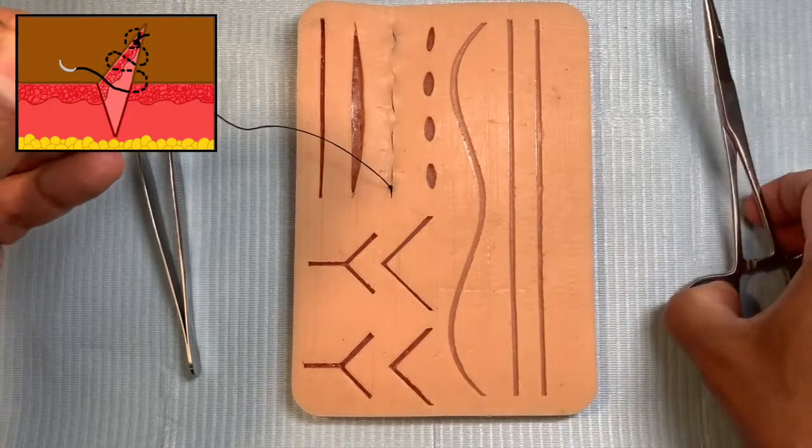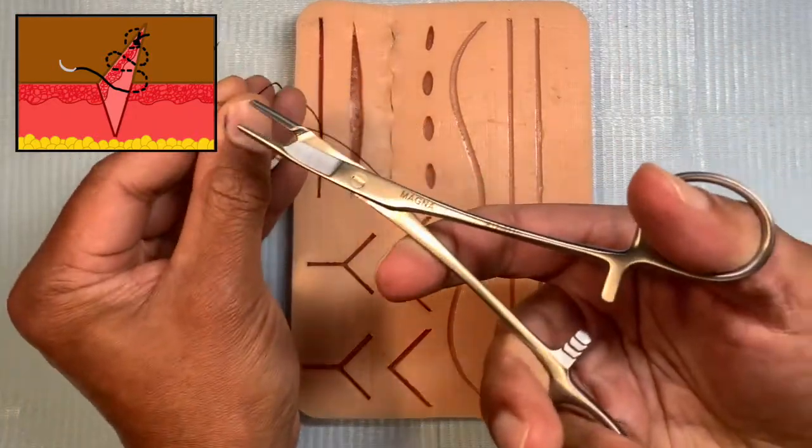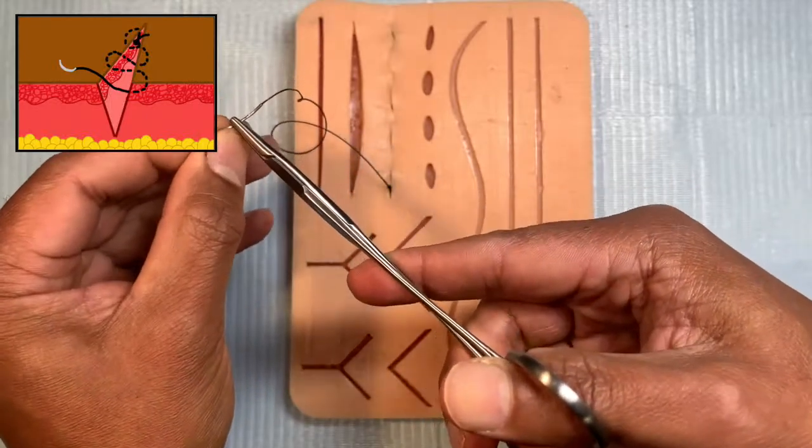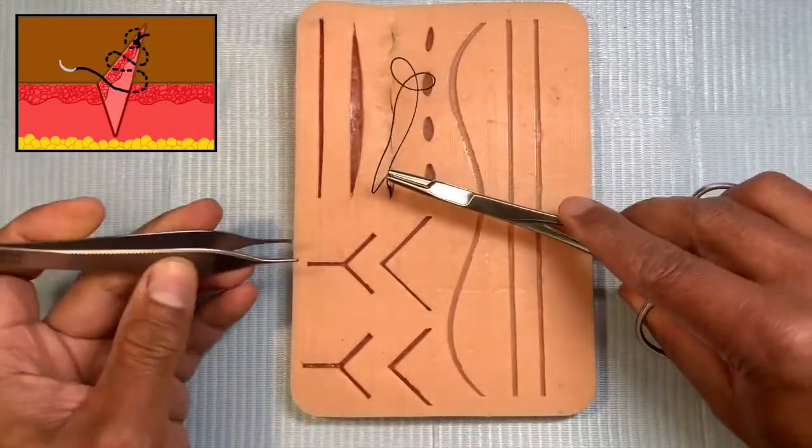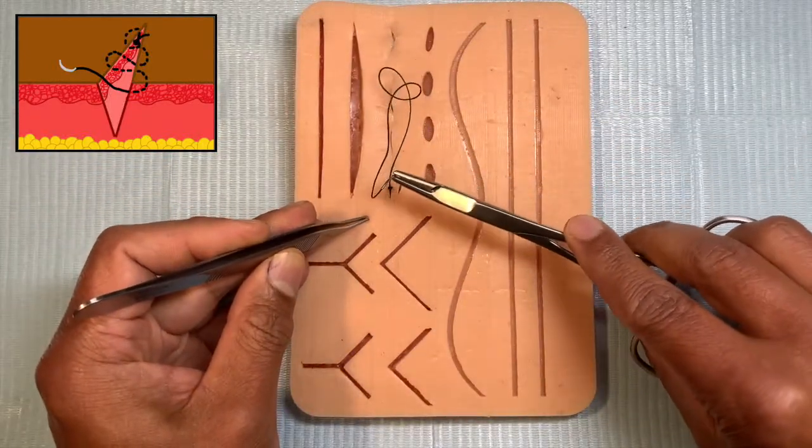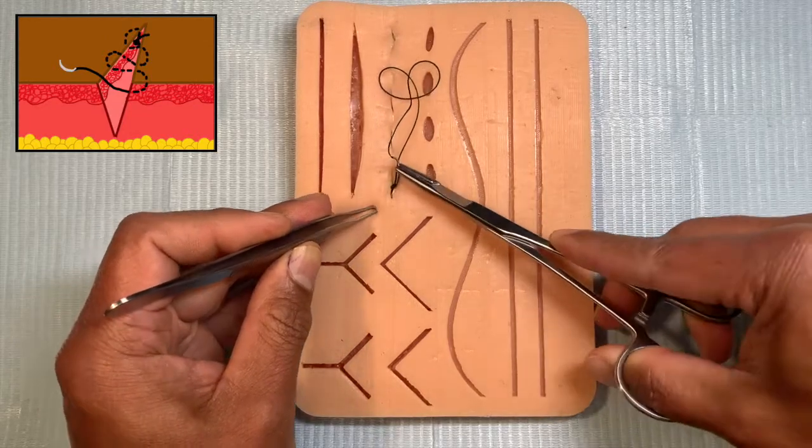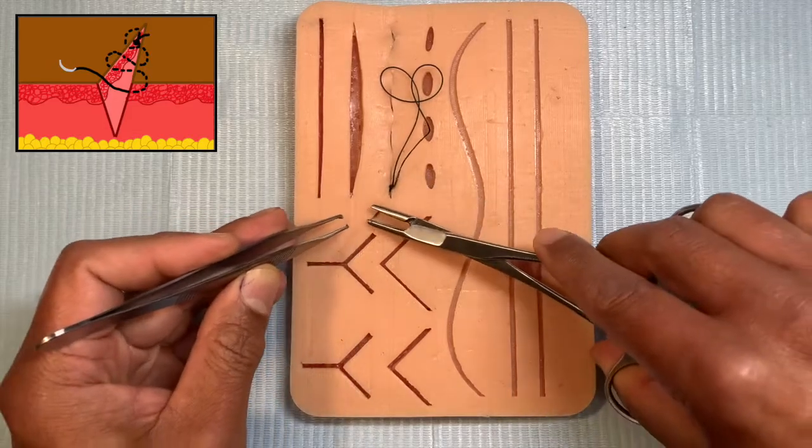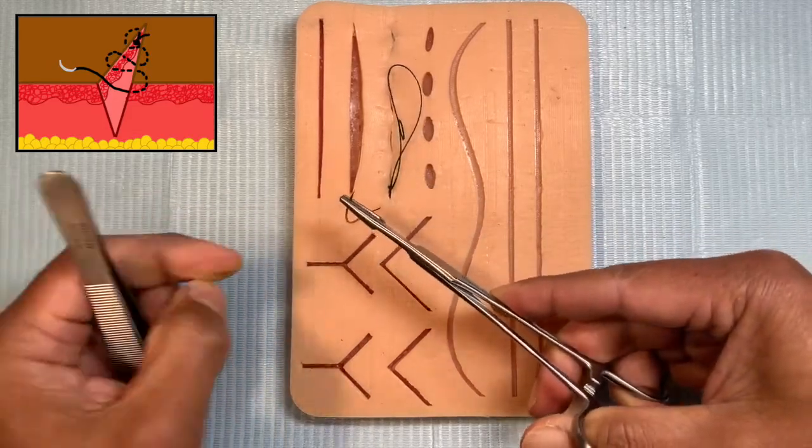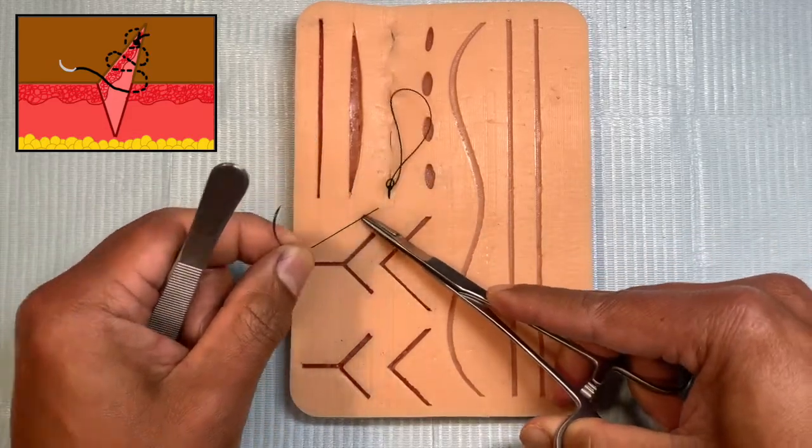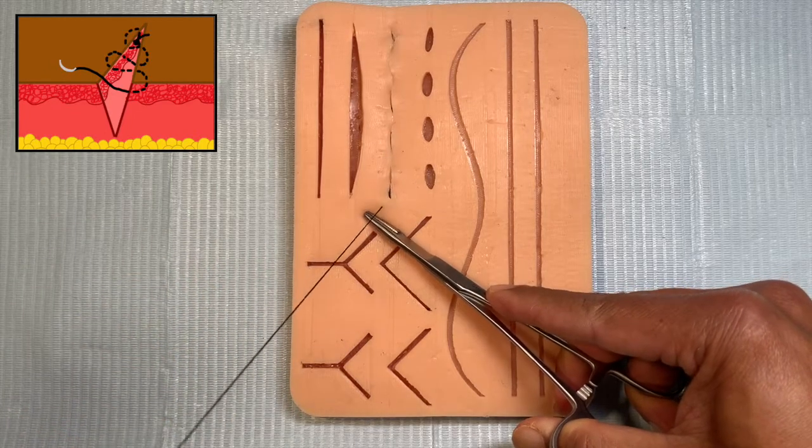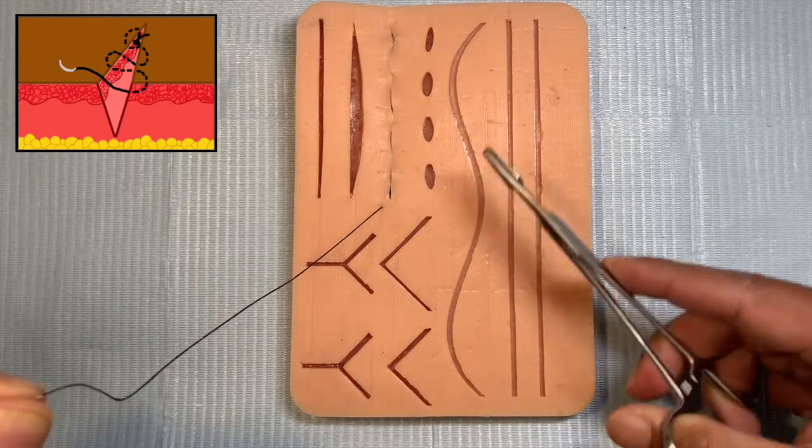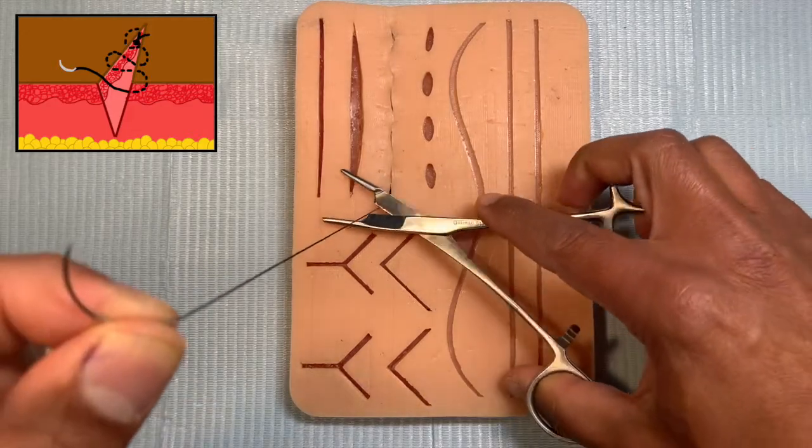Now I'm going to take my needle driver because it's slightly bulky with a total of five throws on it. I'm going to pass it through the edge of the wound in depth so I'm burying this bulky knot inside to maintain the suture without it sticking into the skin. Now the knot is completely buried.